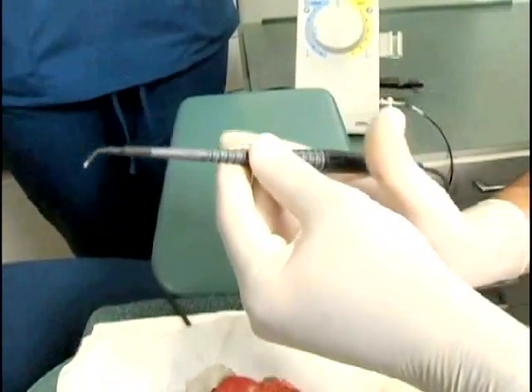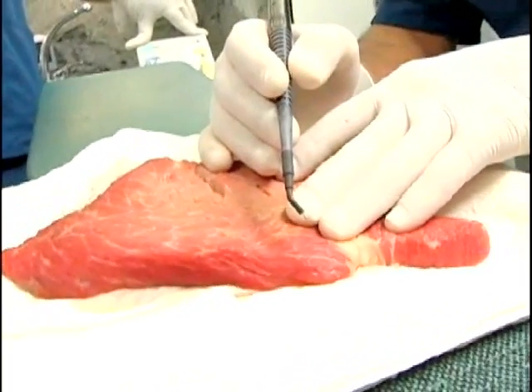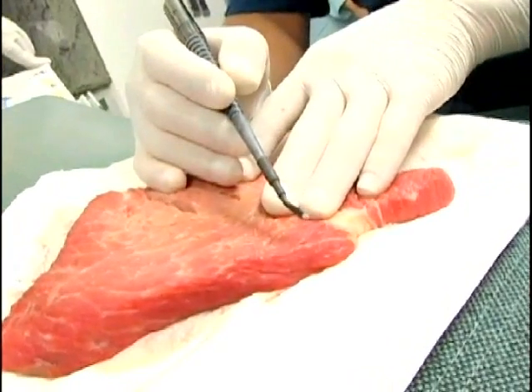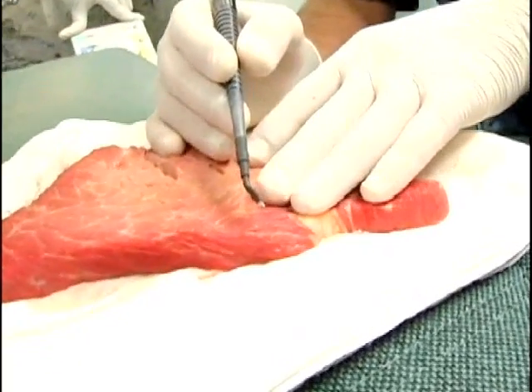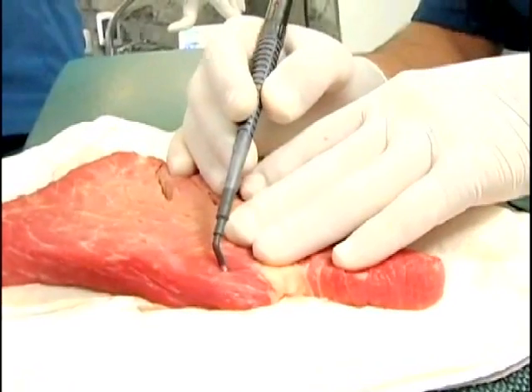Now we are going to simulate a coagulation. For that, we will use the coag ball electrode. It will be an effective coagulation when the treated area blanches. Activate the electrode and touch the ball tip lightly on the meat for about half a second. Blanching indicates a successful coagulation.